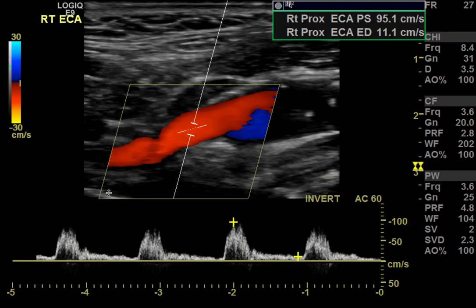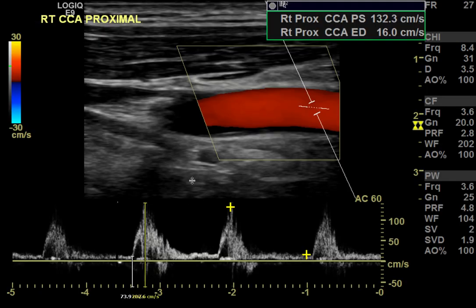This is a patient who ended up getting a carotid artery ultrasound, and the thing that I wanted to point out is the amount of time that it takes for the common carotid artery to reach its systolic peak. And so I drew some lines here that indicate when does systole begin and when does systole end. Now we look at the x-axis down here, which is the time.